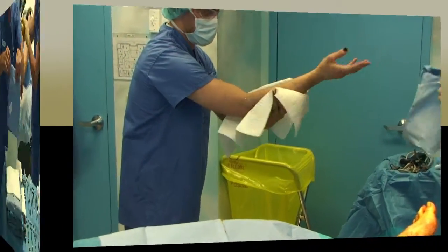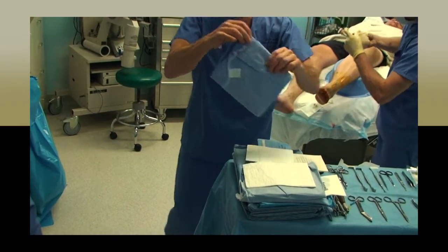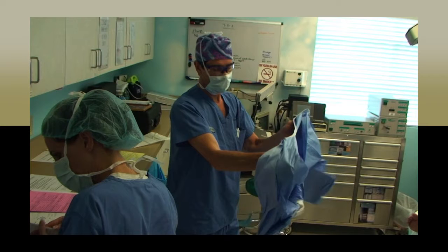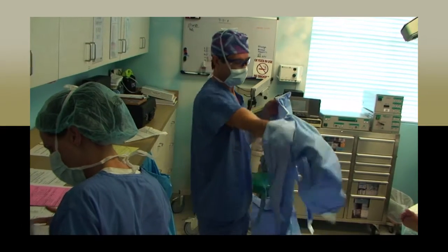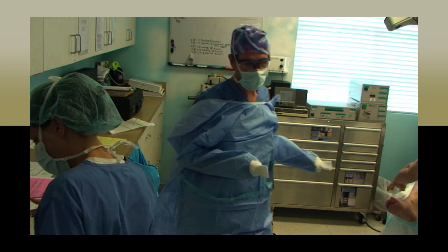When your hands are dry, you will pick up the gown by grasping the gown only. It has been folded such that the surface that will be against your body is out. You will see 2 folds at either side of the gown that has been folded, and you will place each hand in one fold. With your hands in the folds, you will allow the gown to fall towards the ground, thus opening it. The folds your hands are in will open up and become the sleeves, and you will slide your arms into the sleeves, being careful not to fully extend your arms into the field or anything else.